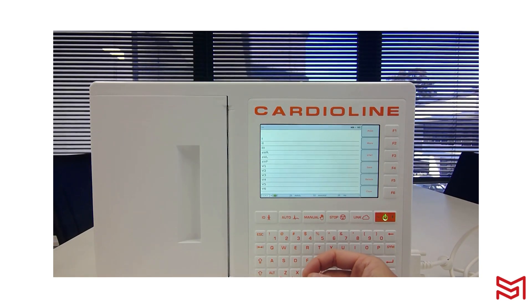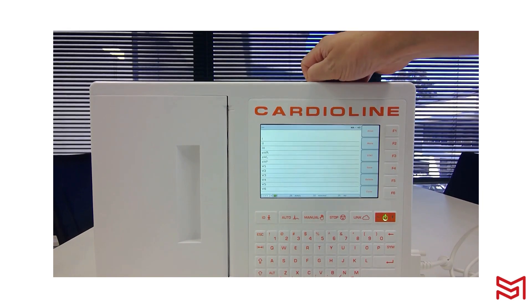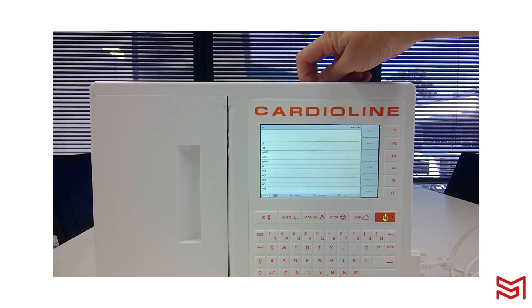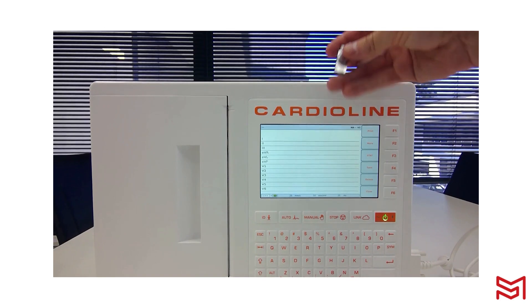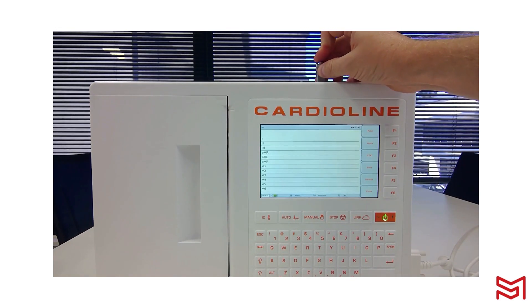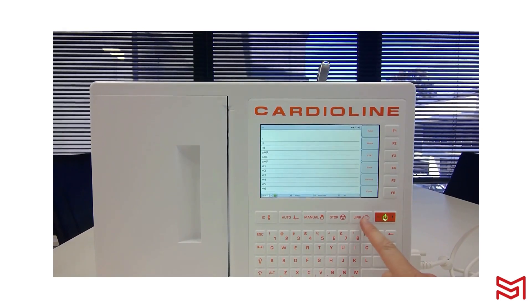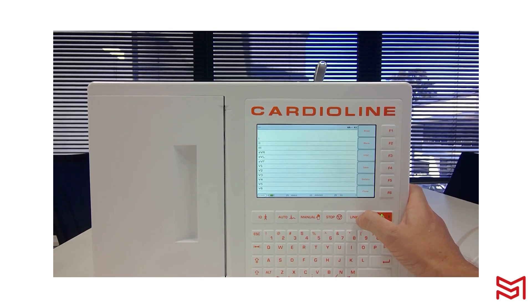Once the ECG has printed, you can export a file in one of two ways: individually or via the ECG archive. Remove the rubber casing for the USB cover located at the top of the device and plug in your USB stick. With the USB stick inserted, click Link — and that ECG will export to your USB stick.